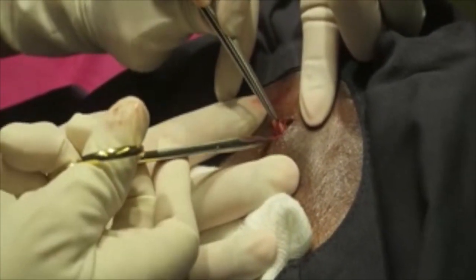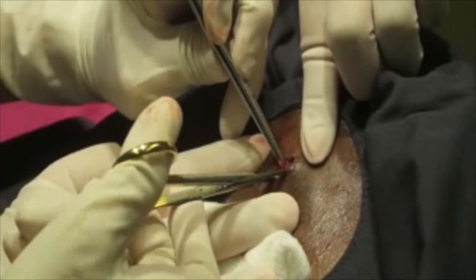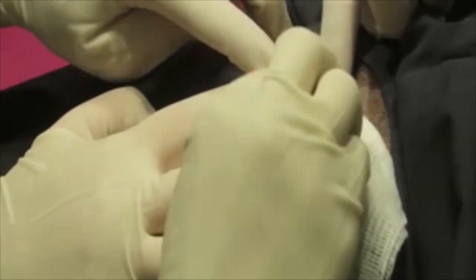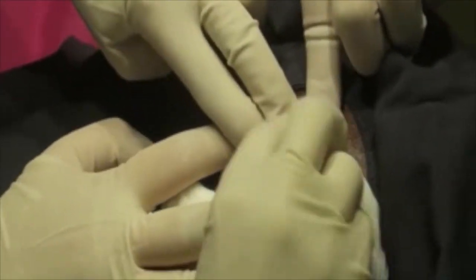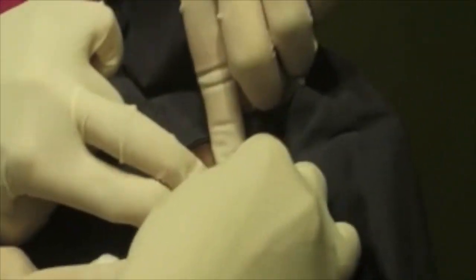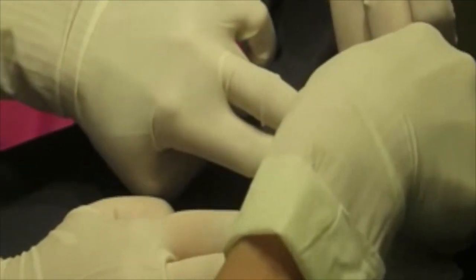Like I tell my patients, it's like it's crowning, the closest you ever get to having a baby. Let's see if I can push that. Maybe I can push it. It's really uncommon to try to push the lipomas out from your head, but I'm going to push on you, okay? Push hard. See if you can do it. I need to push down the top of it, too. I need four hands.